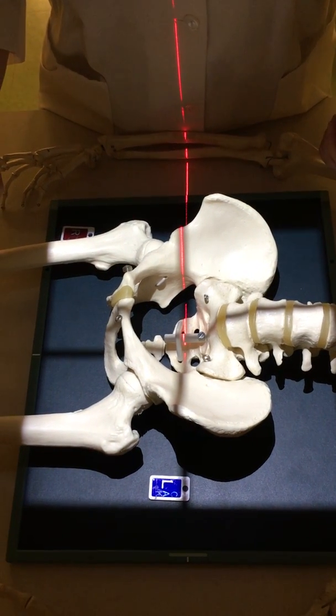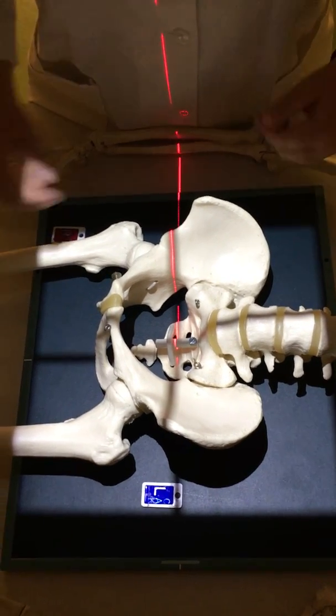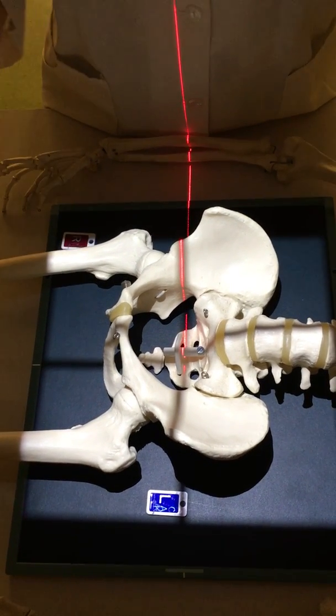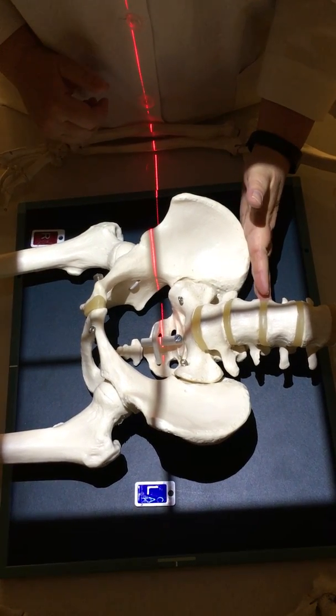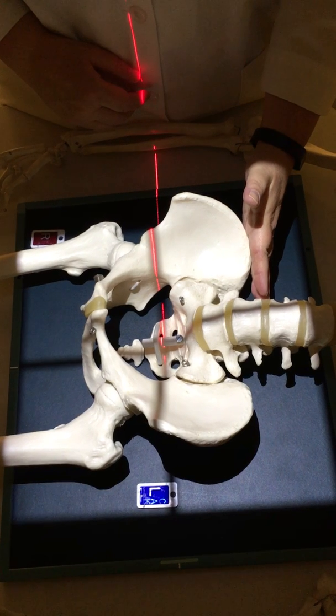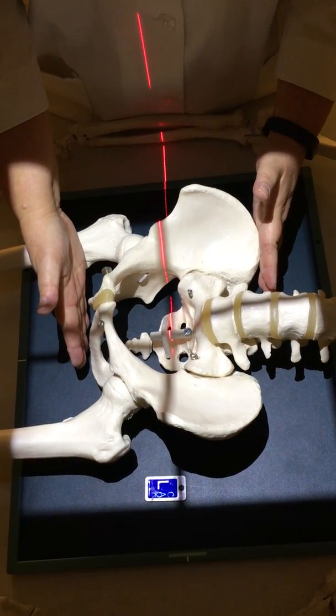When performing the AP pelvis, you do need to collimate top to bottom. You need to make sure that the pelvis is definitely centered to the IR. The top of the pelvis is right here at the top of the iliac crest, and the bottom of the pelvis is down here at the ischial tuberosities.